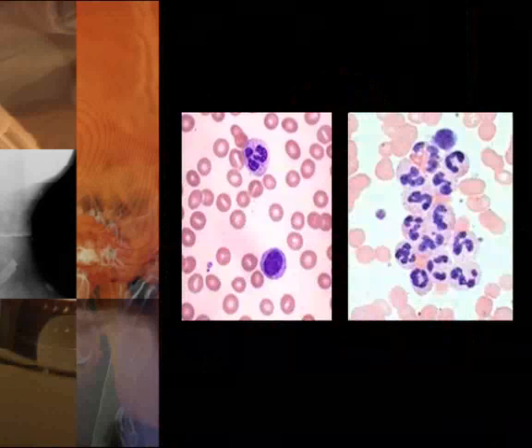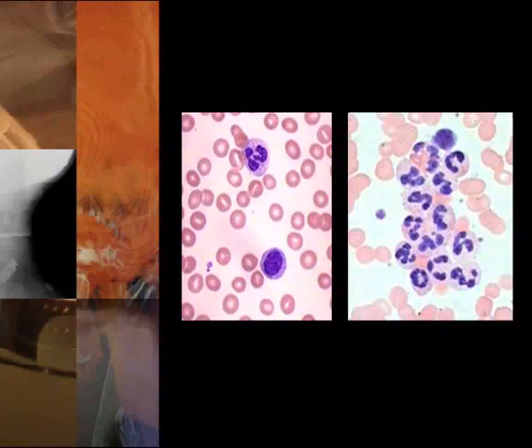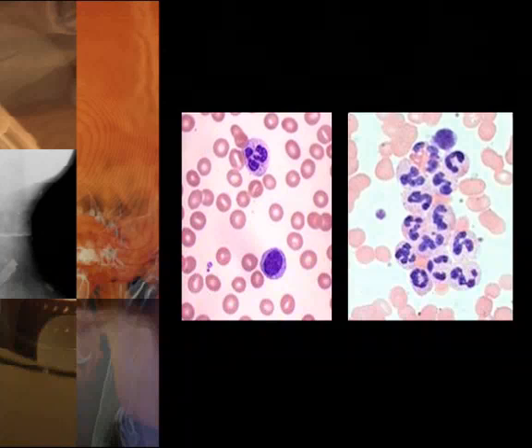When the results come out, the medical technologist has two choices. Sometimes they'll look at the result on the instrument and they'll just give that number right to the doctor without doing anything else. Sometimes they'll look at that result and see that additional testing needs to be done. So the next step that the medical technologist did in this case was actually take another small sample of that blood and smear it on a glass slide and stain it with special dyes so that you can look at cells.